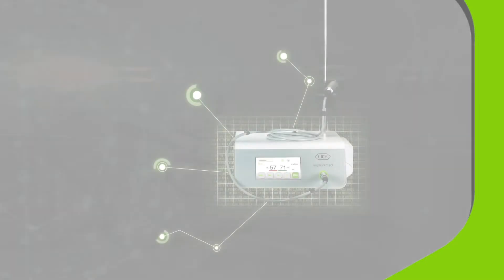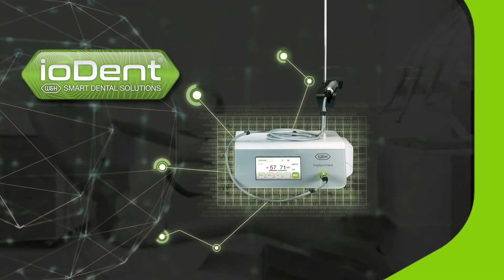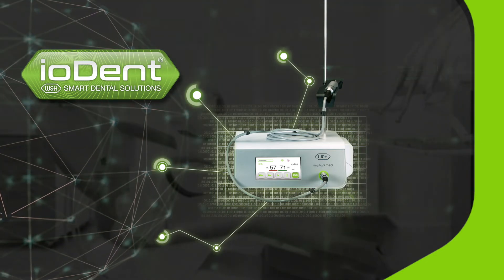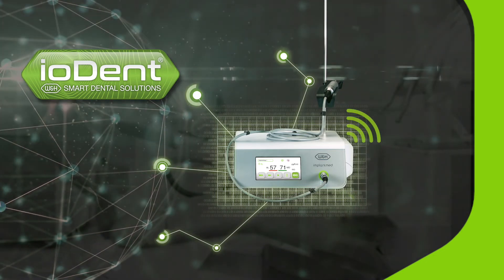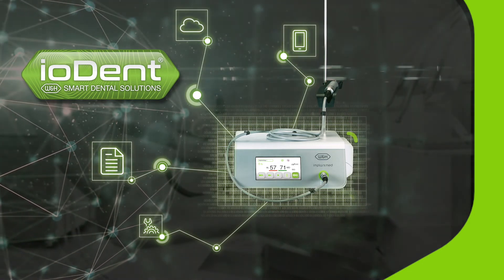For future-proofing, ImplantMed Plus comes ready for Iodent, the new W&H brand for digital dental smart solutions. The Iodent system connects W&H products to an internet of dentistry, making the USB stick a thing of the past.